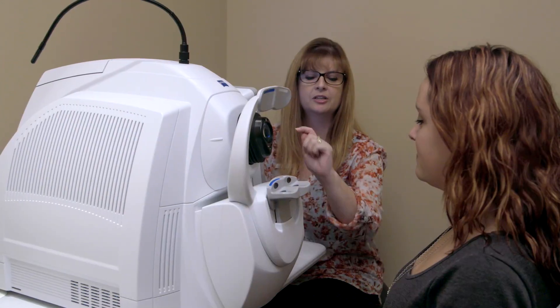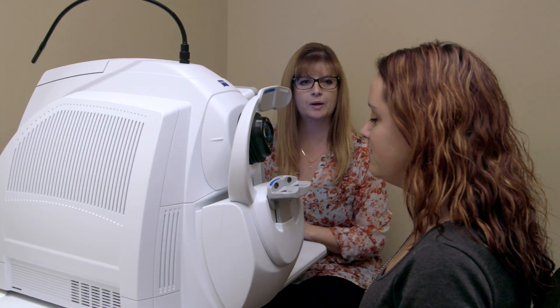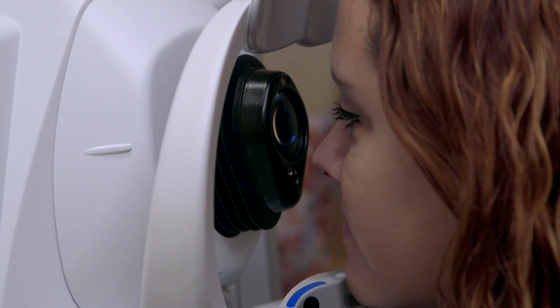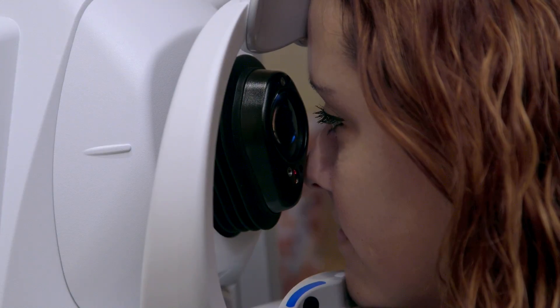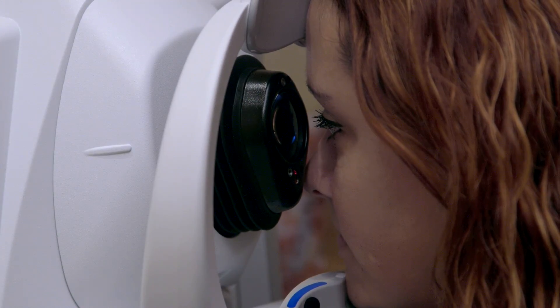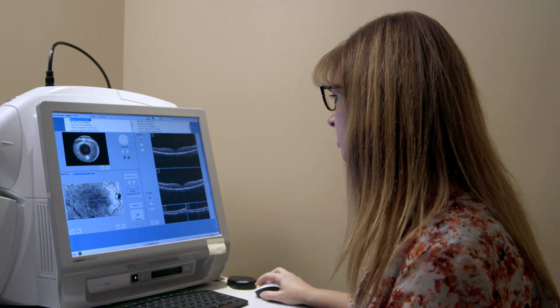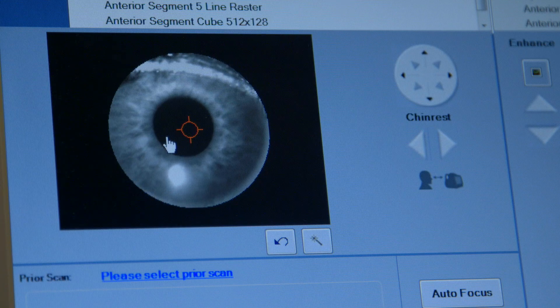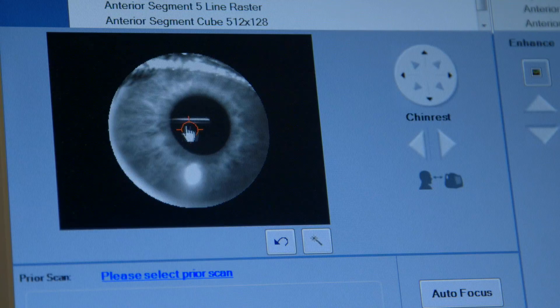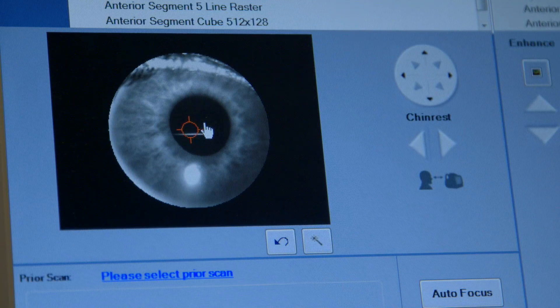The process is fairly simple. Patients put their chin on the chin rest and an optometric assistant will guide you through the process. The patient is to fixate at a target and within seconds we take a scan of the eye. It's safe and effective.